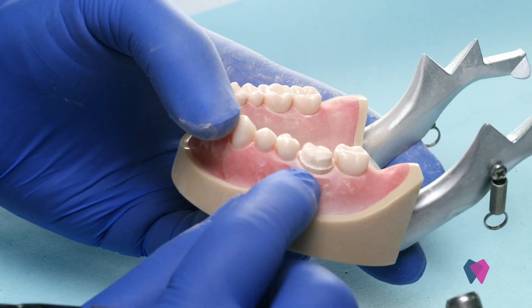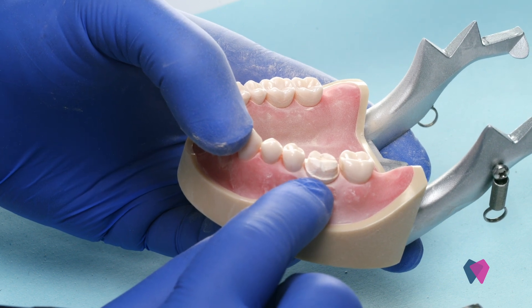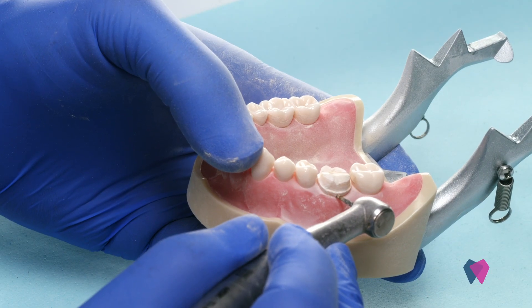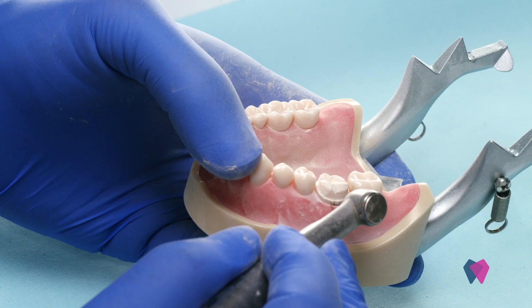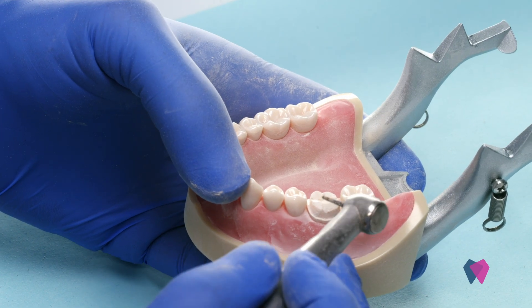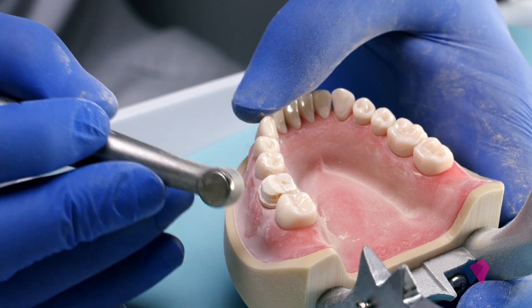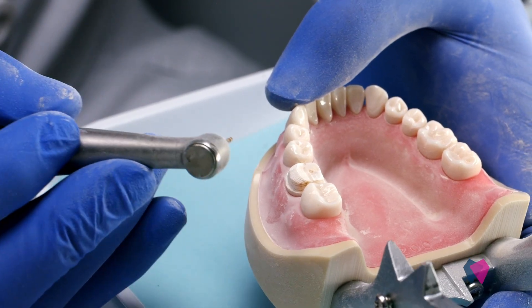Now, if you'll notice, once again, take a look at this tooth. We've got plenty of space here, so we're able to leave this supragingival. Talk to your patient about it. Let your patient know that yes, when we're finished, you might be able to see a little bit of your natural tooth. You can always go a little bit further if they don't want to see that, but try and leave it supragingival so that it's easier for you to check at every hygiene visit. It's easy to find out if there's any leakage. If you go subgingival, you're going to always have the problem that you're never going to be able to see that margin.